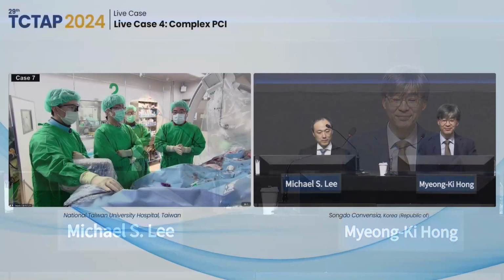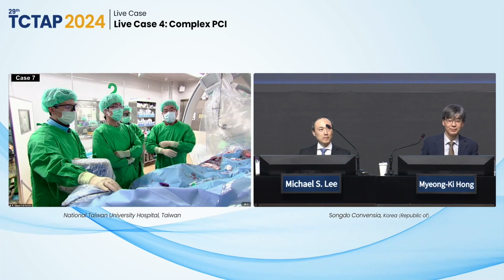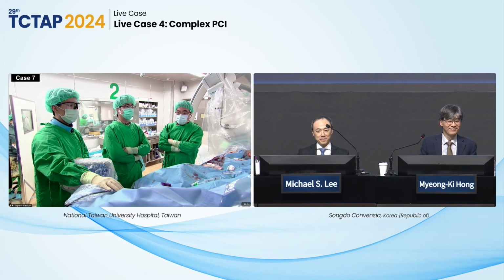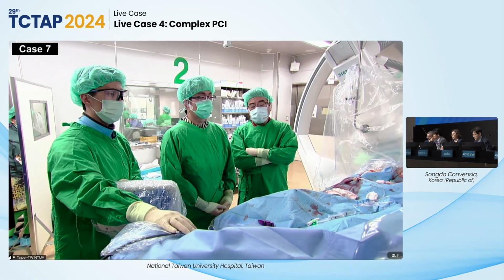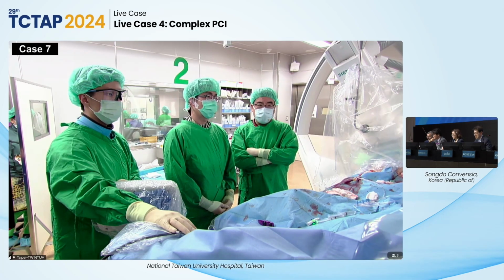Right. Welcome everyone to Taipei. We are now in NTUH, and we are very happy to be transmitting two interesting live cases to TCTAP 2024. Today, my team includes Dr. Ke, my first assistant, and our fellows, Dr. Zhang, Dr. Guanwei, and Dr. Lin. Today we have a very interesting case for you. It's not a CTO, but a very complex bifurcation calcified lesion. I'll let Dr. Ke introduce the case first.